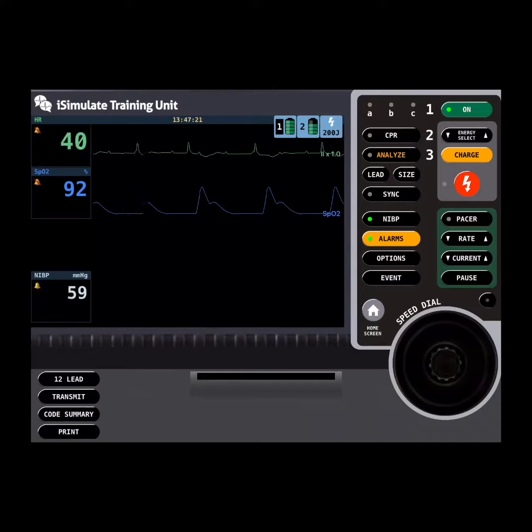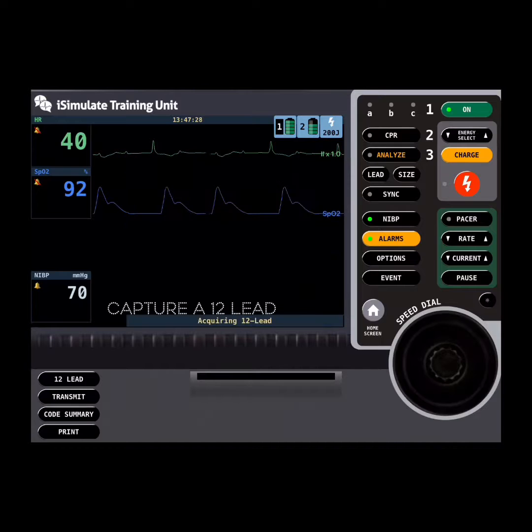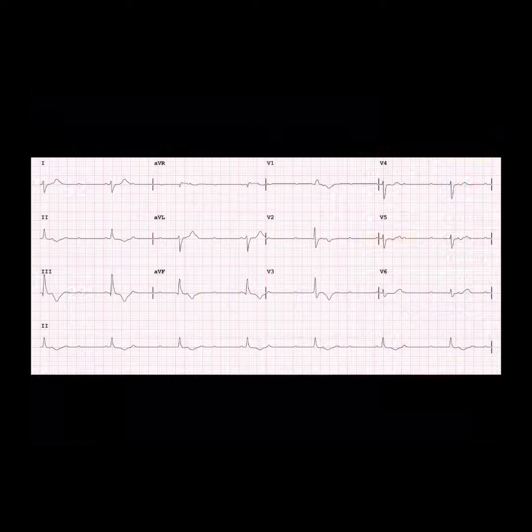They could see on the 3D ECG that the rate looked as though it could be a third degree block. And so they thought, okay, let's have a look at it on a 12-lead. You see the 12-lead comes up here and it's definitely showing a third degree conduction block.